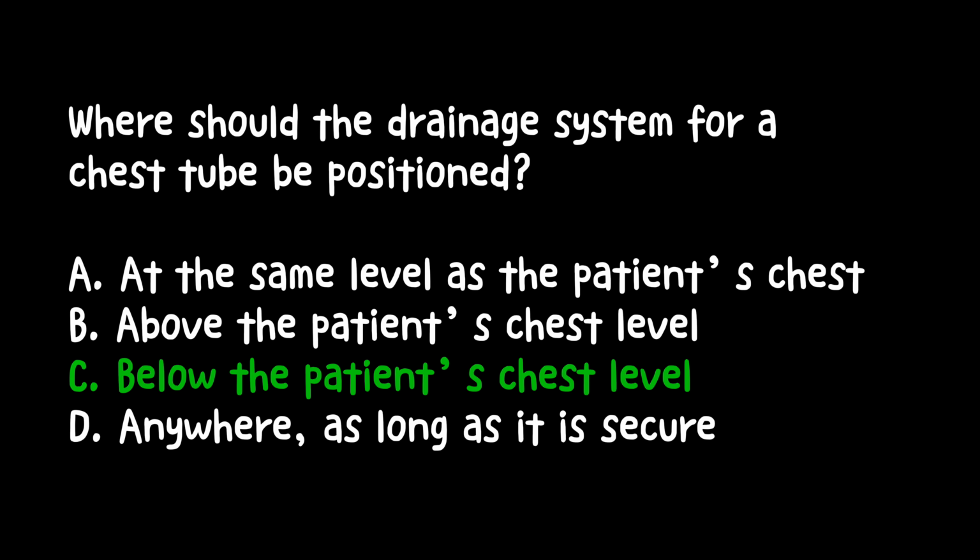So I'm just going to ask a question here. Take some time to think about the answer and let me know. If you chose below the patient's chest level, that was correct.